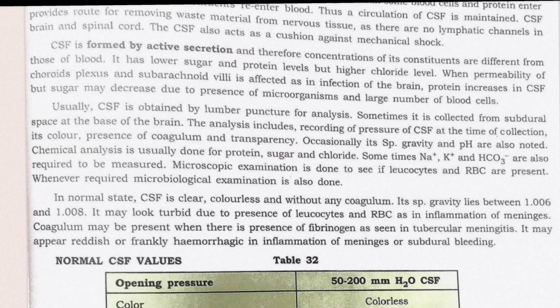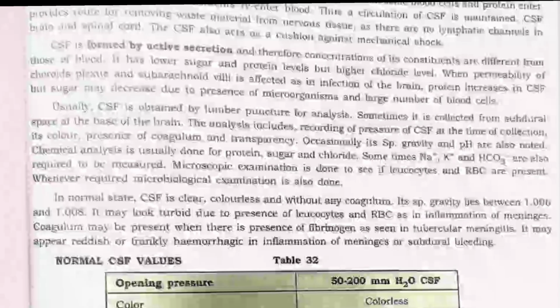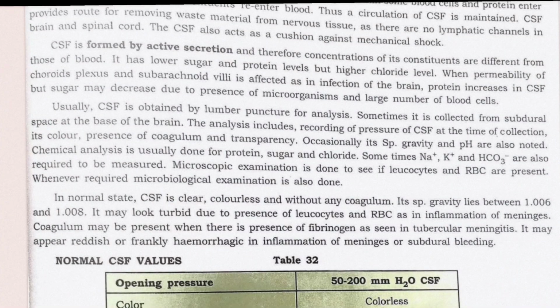Microscopic examination is done to see if leukocytes and RBC are present. Whenever required, microbiological examination is also done. In normal state, CSF is clear, colorless and without any coagulum. Its specific gravity lies between 1.006 and 1.008.